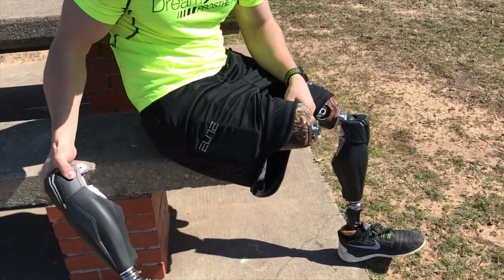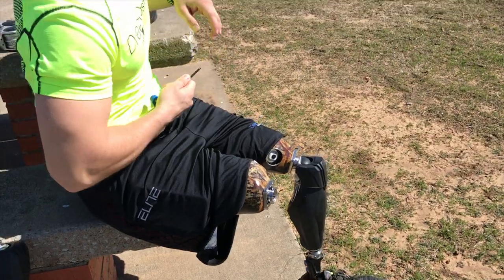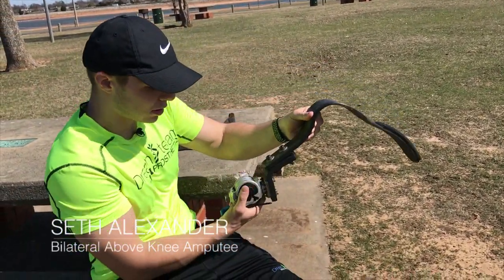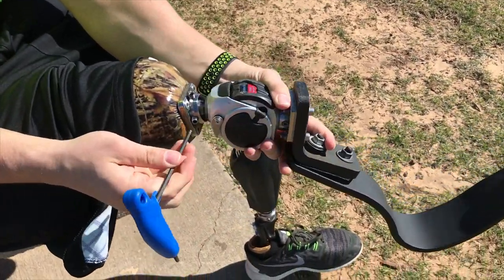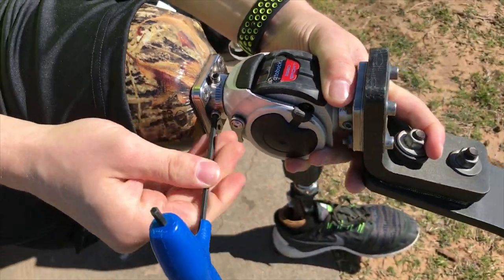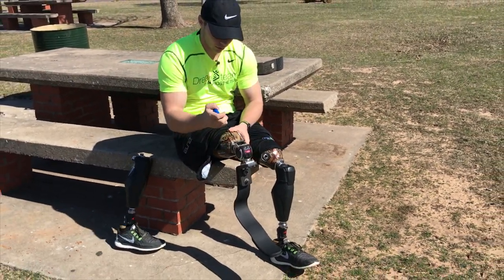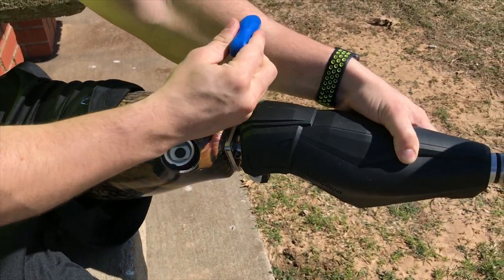I'm taking off the walking leg, the genium, and putting this running leg in place of it. You can see there are two screws here that I'm switching out for the leg. I don't wear a separate socket for different activities — I prefer to use one socket for every activity every day.